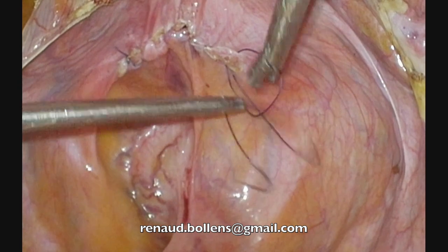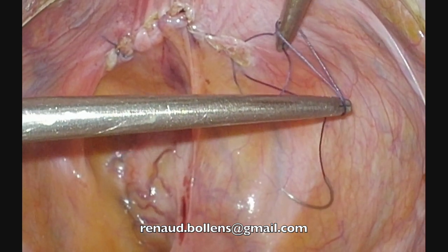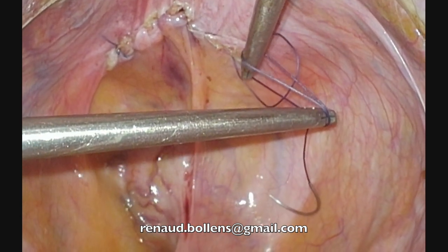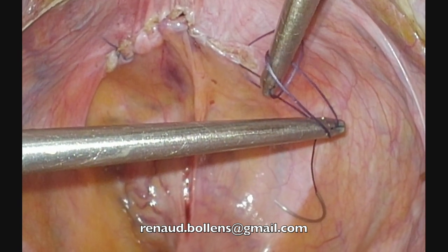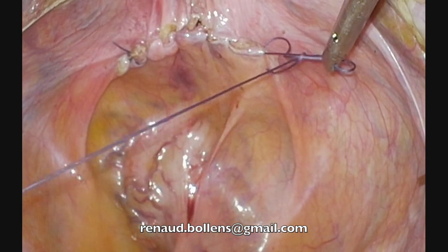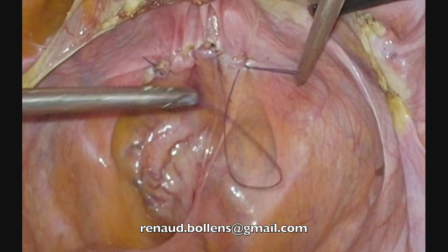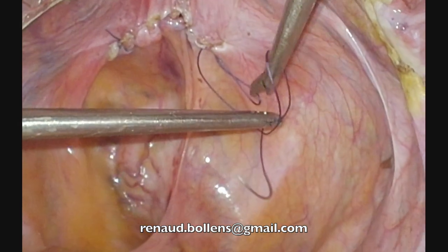Because when I tighten, I do my first one. I don't take on this side. If I take here, the running suture will not be completely tight. Then I take a little bit shorter on the side of the running suture, okay? Because now, when I tighten, I will re-stretch a little bit the running suture, okay? For the second one, it is a little bit different. I catch the tip, the loop.